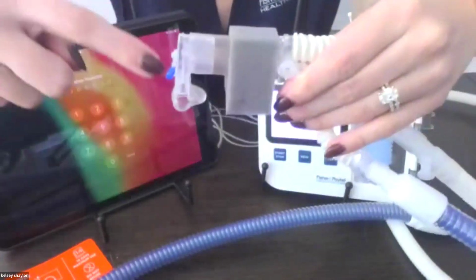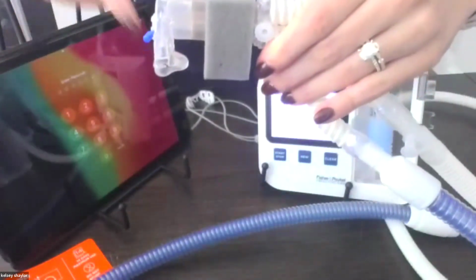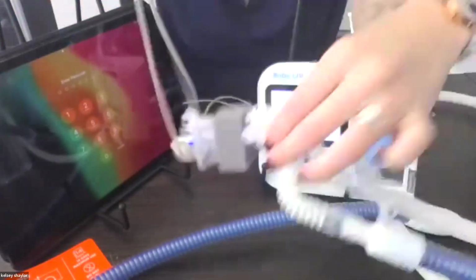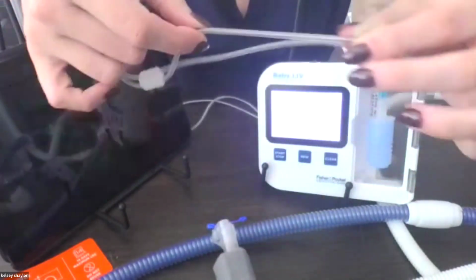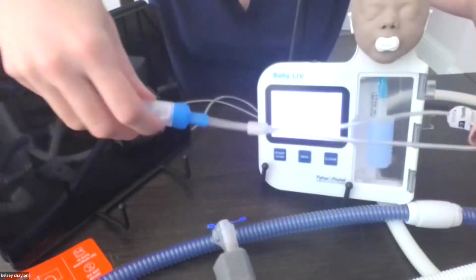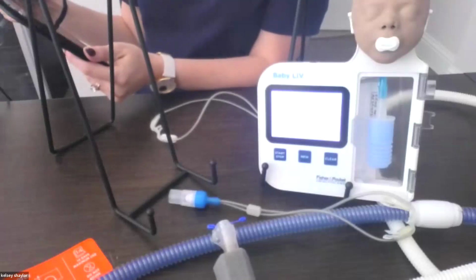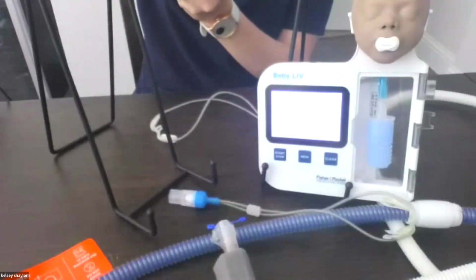On this interface, we do have exhalation possible right at the baby's airway. When they're exhaling, that gas exchange or that expiratory limb is right here at the baby's nose. When you're using a cannula, like he was mentioning, they really can't breathe out through these prongs because the flow is coming in from both sides. They would have to get past all of that pressure coming in and then get back here to actually have effective gas exchange. But there is no expiratory limb, which makes it very difficult for them to breathe out if you were to fully occlude with a cannula. So let me just wake this up really fast so that I can actually do a demonstration for you.